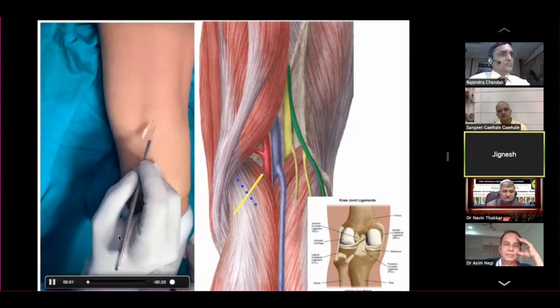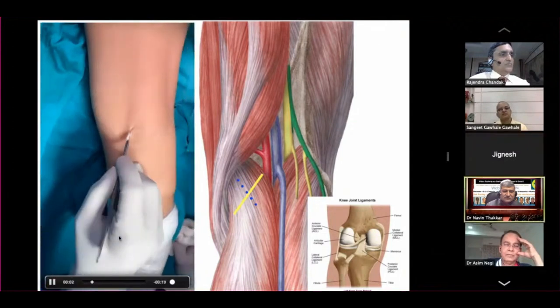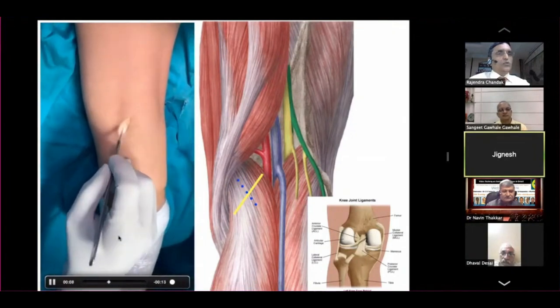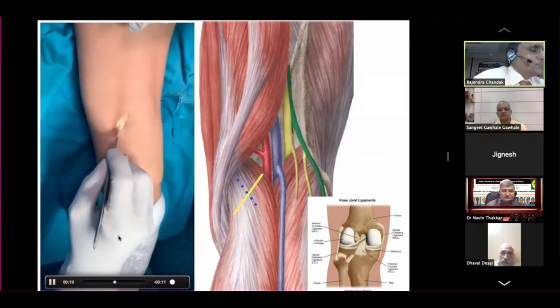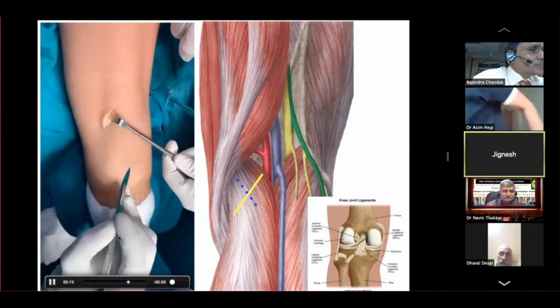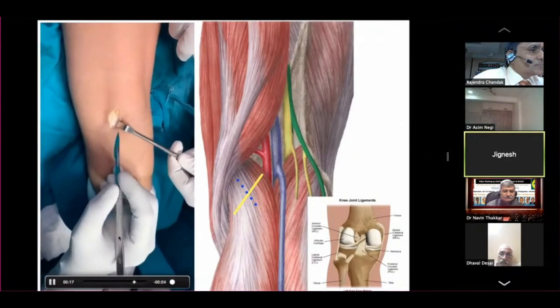That is the incision — about one inch. Across the crease, oblique incision — small cut through skin and subcutaneous tissue and we will release to the fascia.